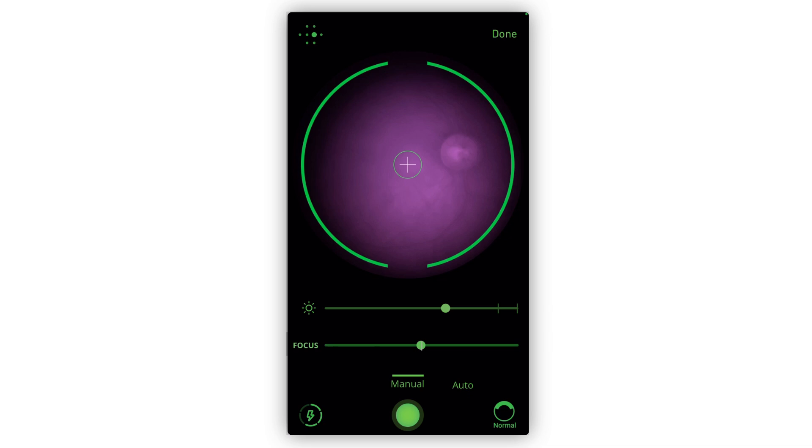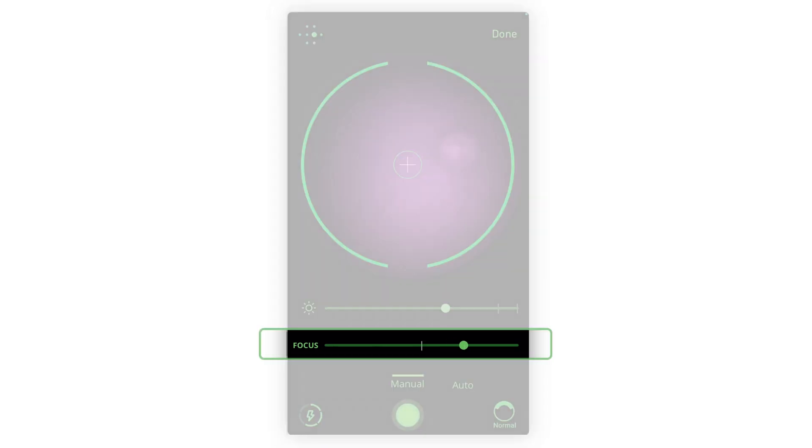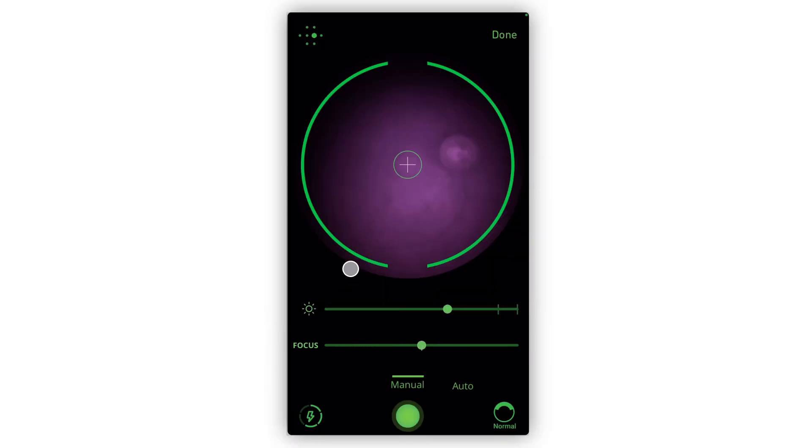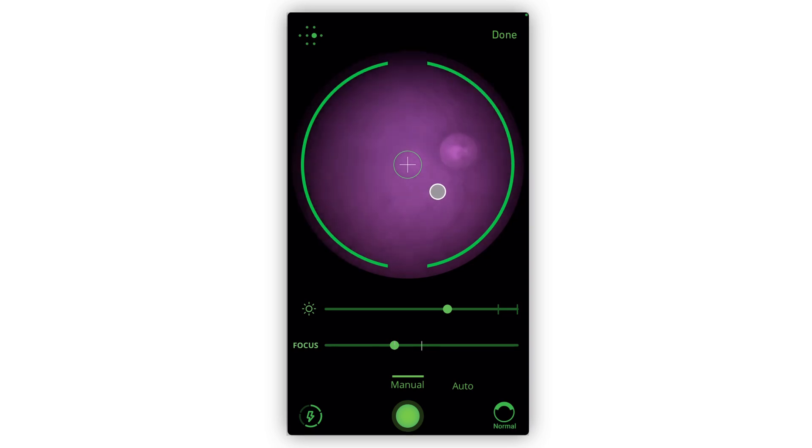To adjust focus, use this slider instead of the focus wheel. An easier way to focus is to tap on the screen and the slider will automatically set itself to the right position.